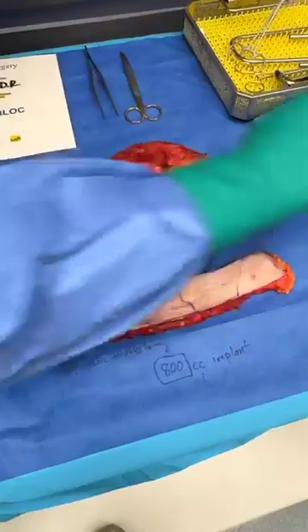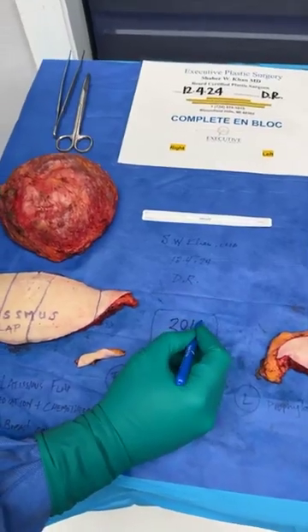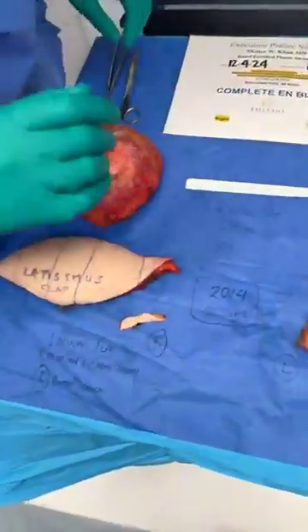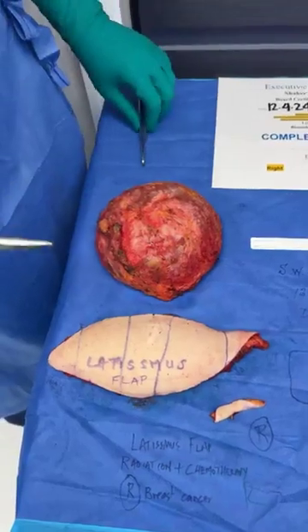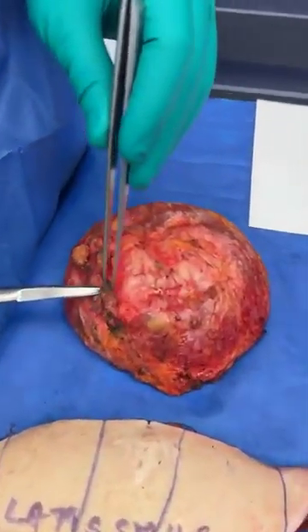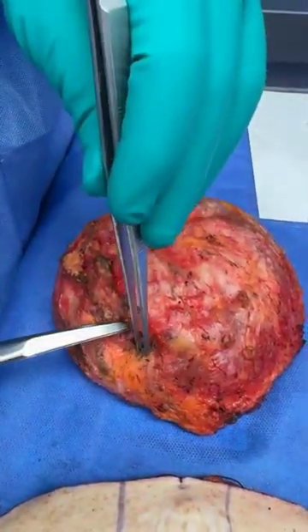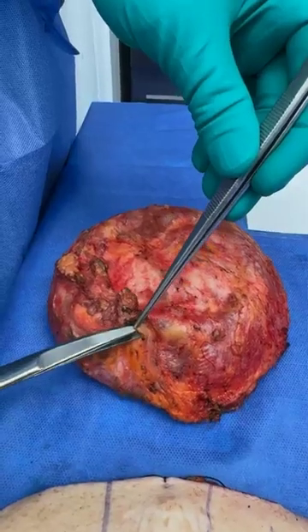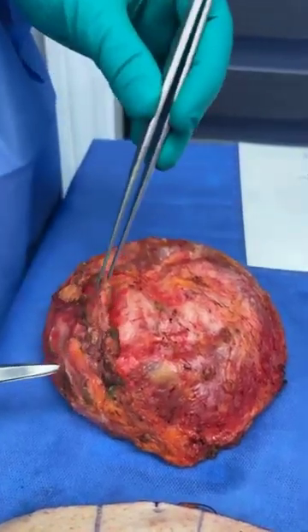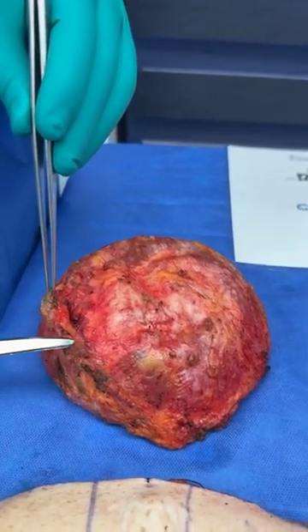And if I may mention, this was your 2014 silicone implant in the standard fashion using alloderm and using basically a significant amount of Ethibond suture. So if you look over here, look at this. You have, look at this right here. This green, it's a braided suture. It's very thick. It was used to anchor in. And all of this suture with the scar tissue, granulation tissue, all of this was removed.